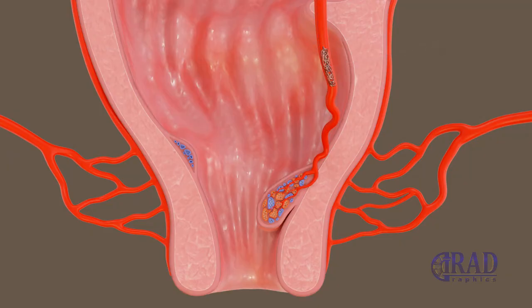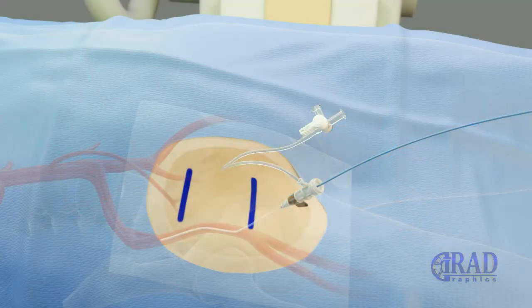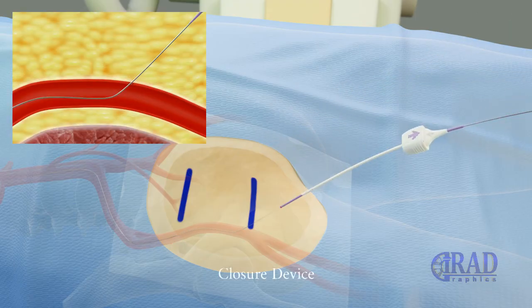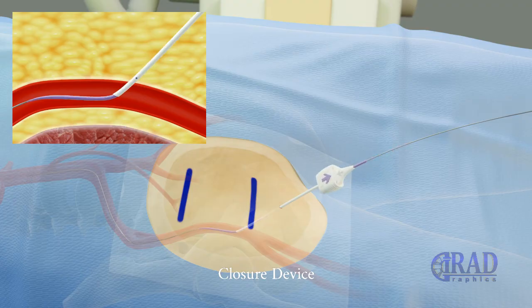Upon completion of the embolization, the catheters are removed. Hemostasis is achieved either by applying manual pressure or a closure device. For active closure device, first a short wire is advanced through the sheath into the common femoral artery. Then, the vascular sheath is removed and a special sheath and dilator provided in the closure kit is advanced over the wire into the common femoral artery.